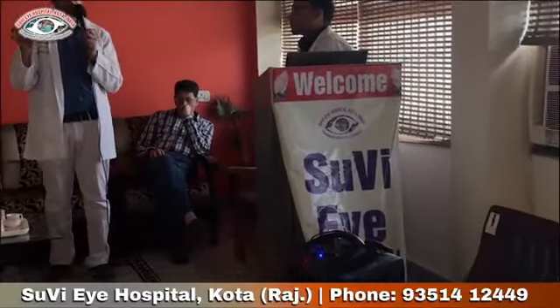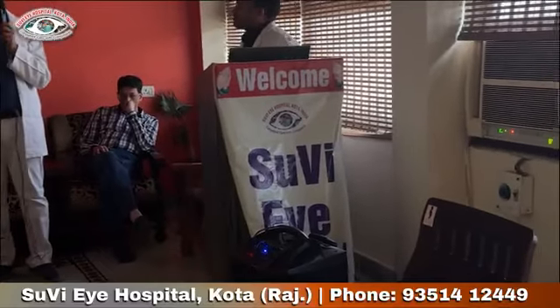So we do a prophylactic barrage before the refractive surgery because if, after many years, anything happens to the retina or a retinal detachment happens, the patient will blame the refractive surgery, because he does not understand the technicalities of this situation. So that's why we do it prophylactically.